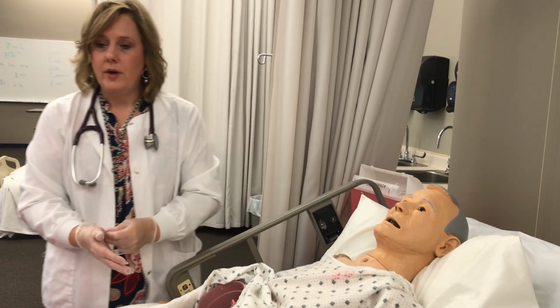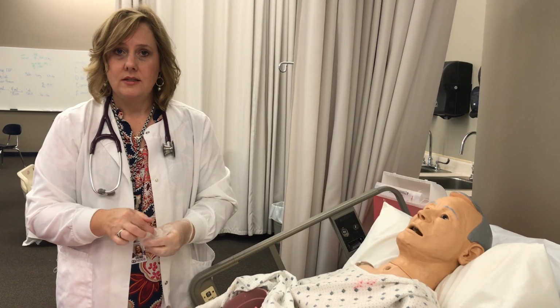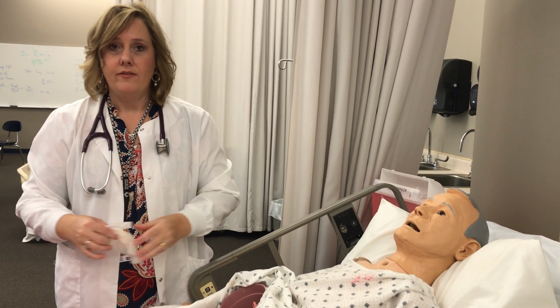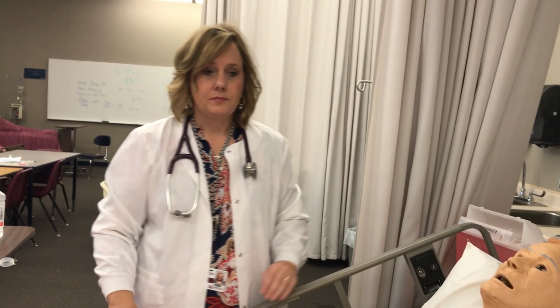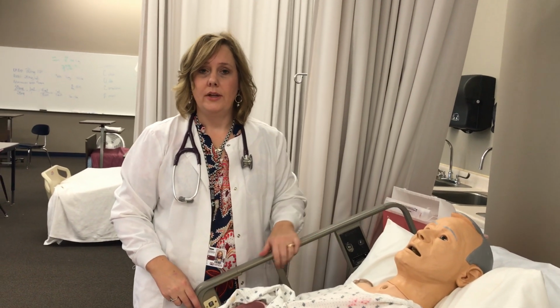And then at this point, we will chart everything. We'll need to wash our hands. We'll dispose of any biohazards that we have. Make sure the bed is in the lowest position, and make sure the call light is within reach. And make sure your side rails are up as well before you leave your patient.